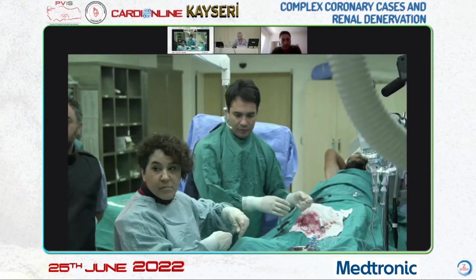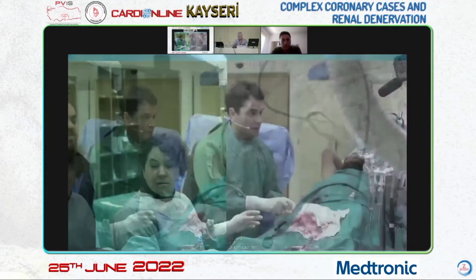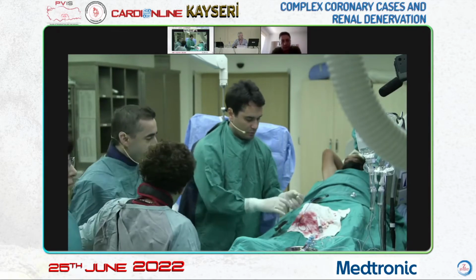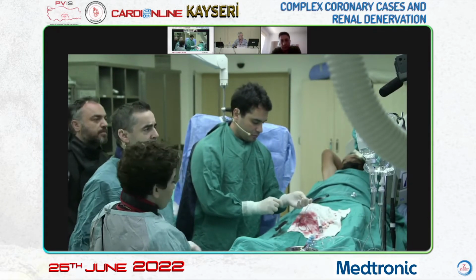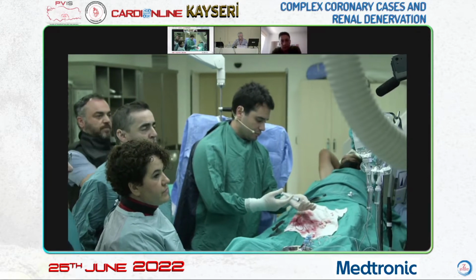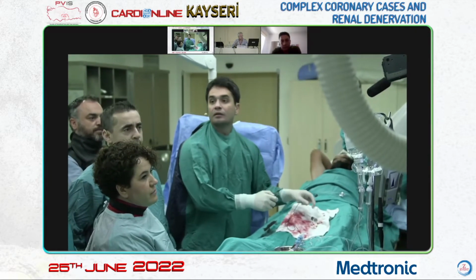Can you please give the particulars of the case first? First, let us present the case. This is a lesion we have.